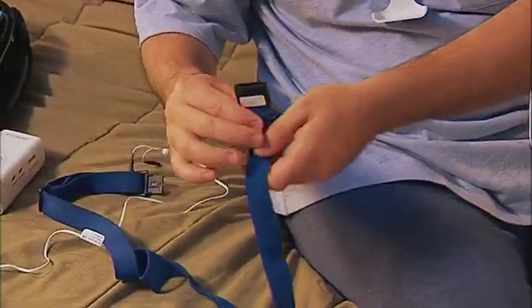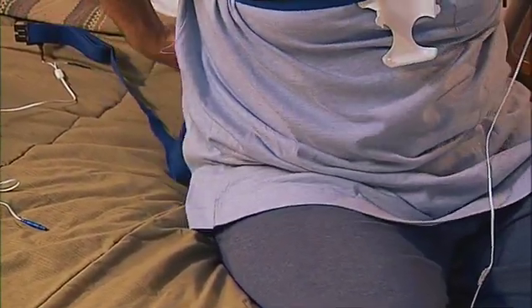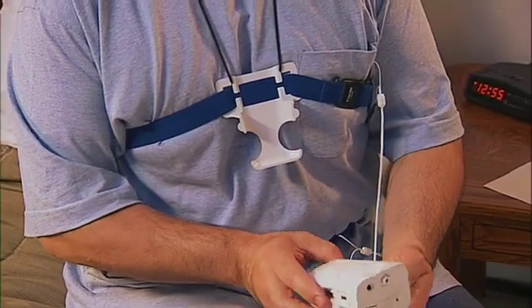Next, wrap the blue abdominal belt around your stomach and connect the two belt ends together so they are directly over or slightly below your navel. Make sure the two belts are not loose enough to rotate around your body — if either belt is loose, adjust the slack.